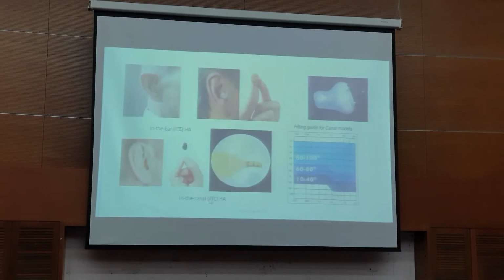so that's behind the ear. And of course, this is the old one, the in the ear hearing aid. Probably you still see older people wearing the in the ear hearing aid, as we call it. You can see the in the ear hearing aid is very small. So if we want to fit an in the ear hearing aid to adults, we also have to look at dexterity problems. For an old person who stays alone at home and wears these tiny hearing aids, holding it and putting it in, it falls. Can't see it anymore.